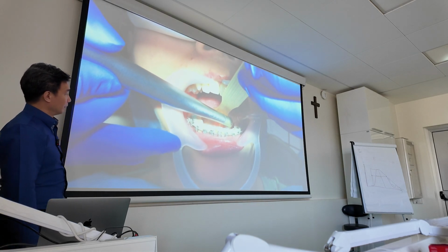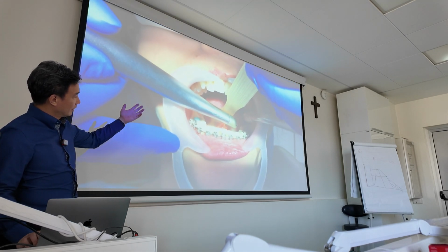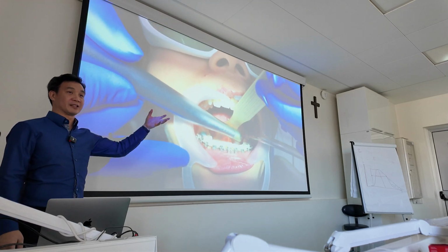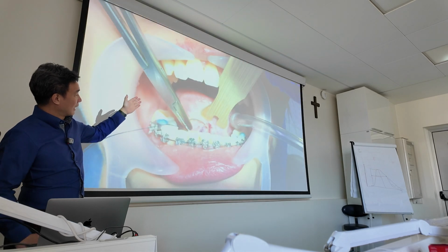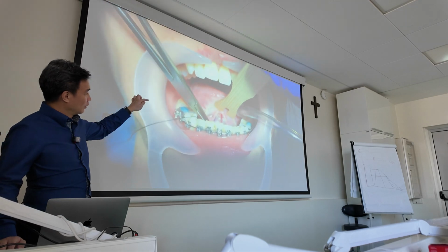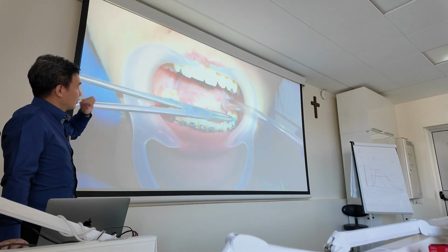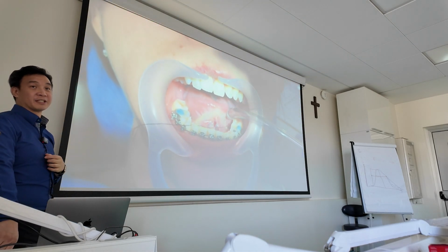As we go through this, what I like about the system is that it allows fine dissection. I can cut through everything and leave that vessel right in the middle, so I have a chance to do a bit of ligation first before I proceed further.